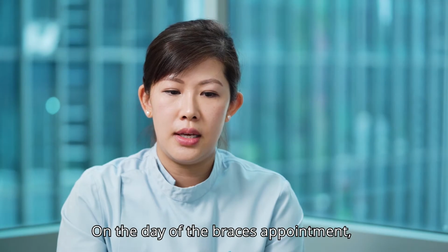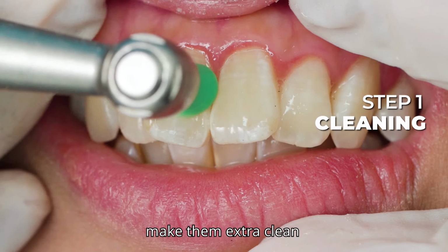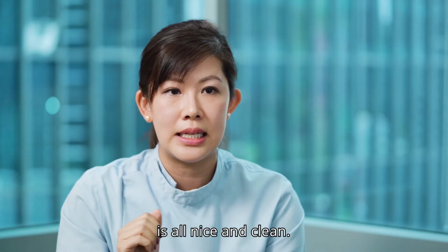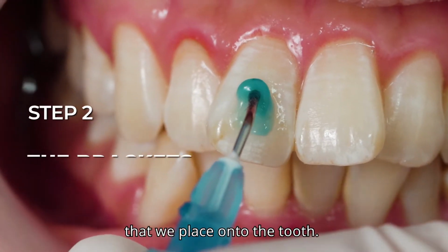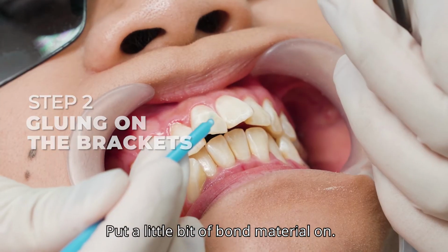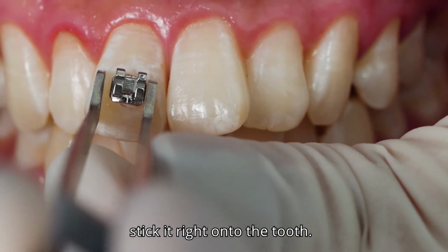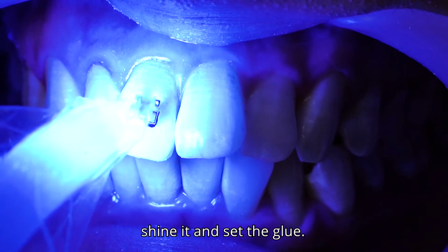On the day of the braces appointment, we'll need to polish your teeth, make them extra clean so that the braces that we put onto the teeth won't fall out. Afterwards, we use a little bit of a chemical that we'll place onto the tooth. We wash and dry it off, put a little bit of bond material on, and then on the bracket itself, we'll put a little bit of glue on, stick it right onto the tooth. Use a little blue light, shine it, and set the glue, okay?